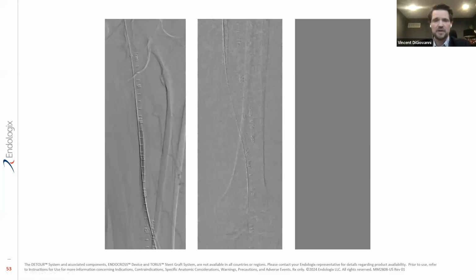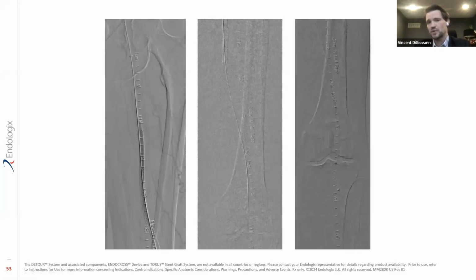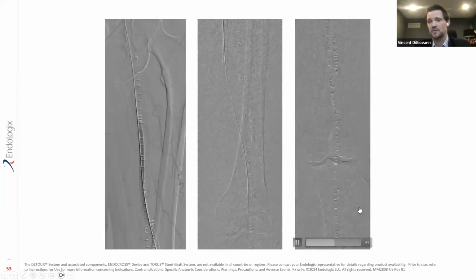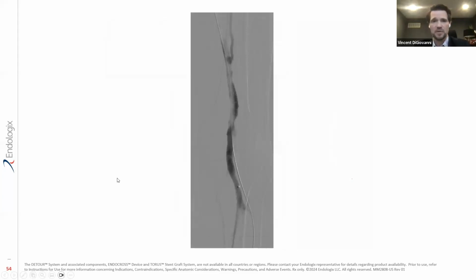And going back to what we were talking about earlier, what you will frequently see is contrast holdup. Unfortunately, I didn't have it on here, I apologize. The contrast holdup, as it's going through the stent itself, will usually be situated somewhere near that distal anastomosis. And again, I have no science leg to stand on when I say this, but I think it's very likely related to peripheral vascular resistance. And with a little bit of nitro, you see that blood flow go through there much better.